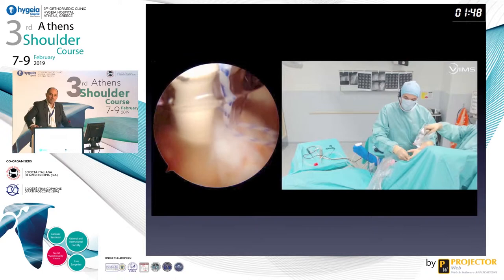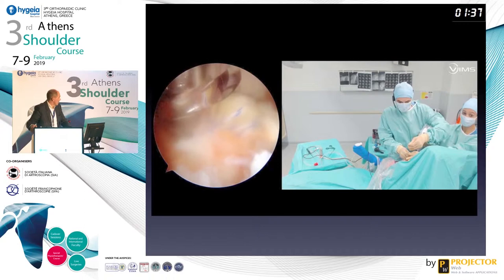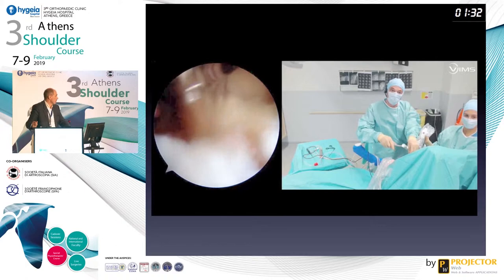And now, as you know, I've stopped the tunnel. I've stopped the tubularization because I had some rupture in the turn of the tendon between the bone and the tendon in the U-turn. I call this the guillotine effect. And now I prefer to fix it flat.